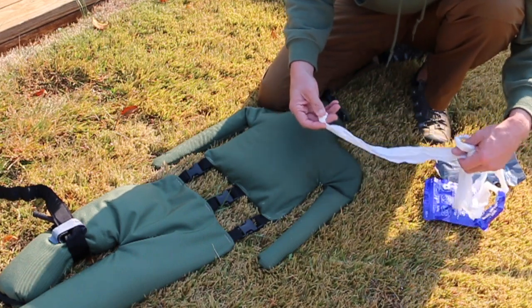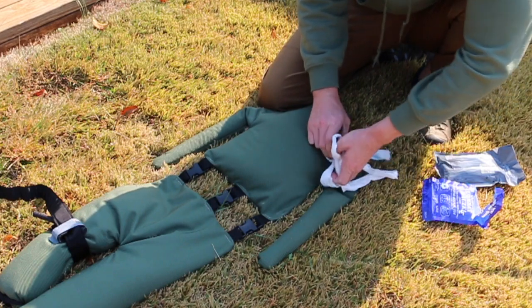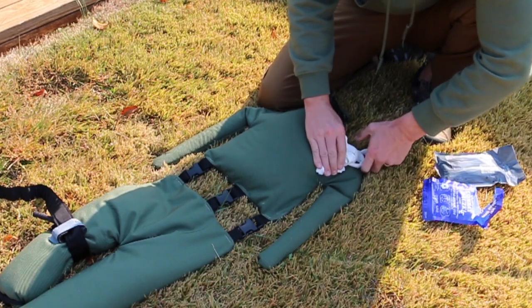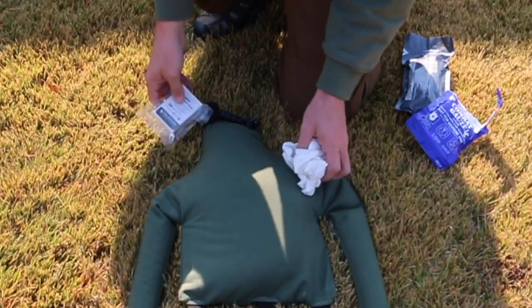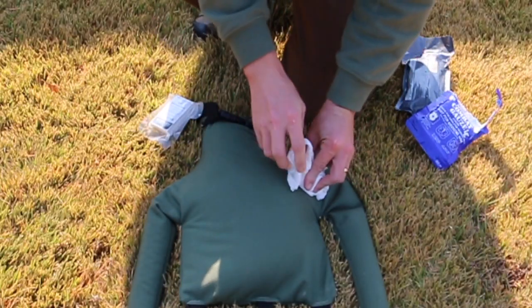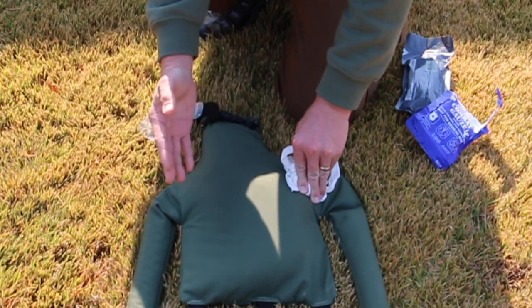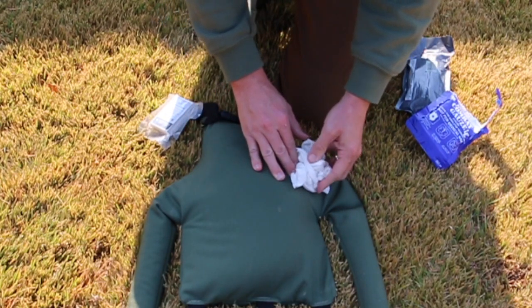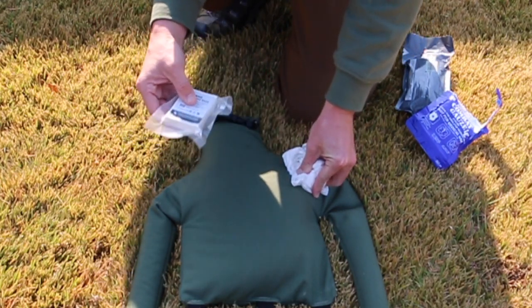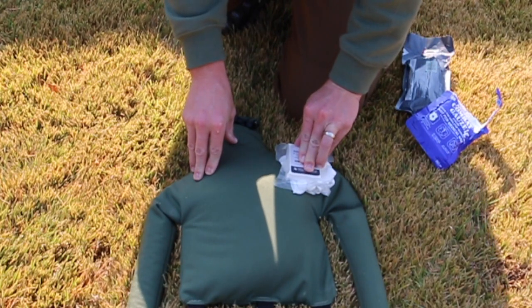So, because you didn't get it to the source. So if you had continued bleeding after 3 to 5 minutes, we would wound pack this again and get this all there and secured. All right, so what I normally try to do is wound pack the wound first with combat gauze, Celox, hemostatic agent, to get it to the source of bleeding first. If I have a large wound and I need more than one gauze, then I can usually use regular compressed gauze here to backfill it.